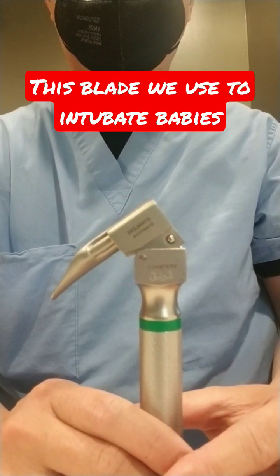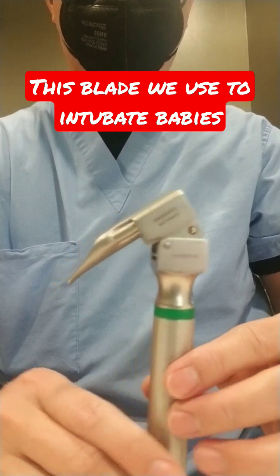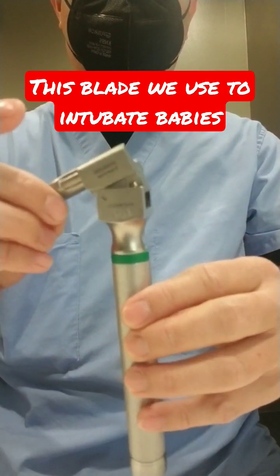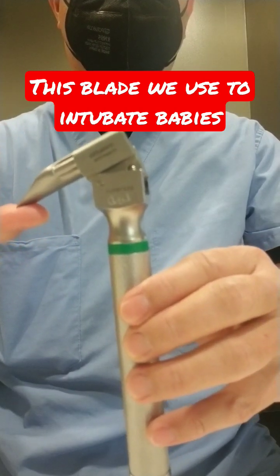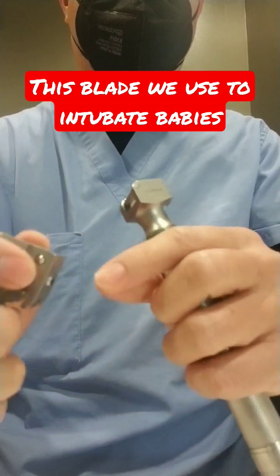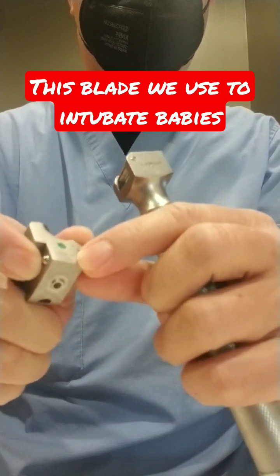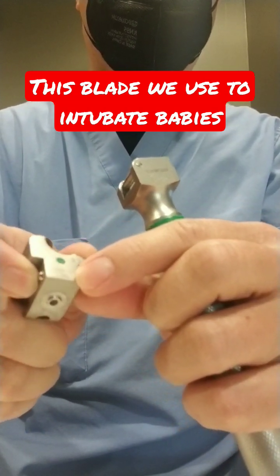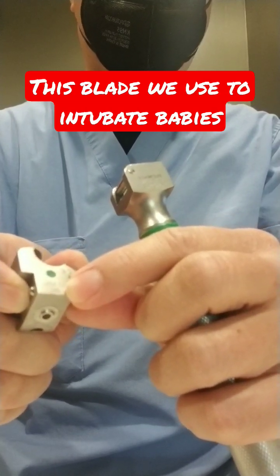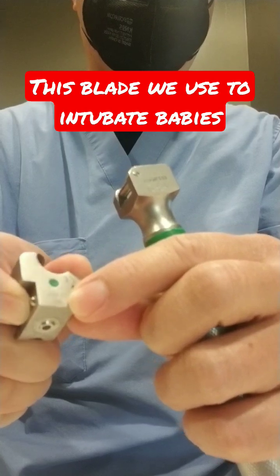If a baby is in distress and needs to be intubated, we use this laryngoscope blade. This is what we call a laryngoscope Miller blade. There is sizing for this — if we look over here closely, there are numbers. For a term baby we use a size one; if it's a preterm or premature baby, we use a zero.